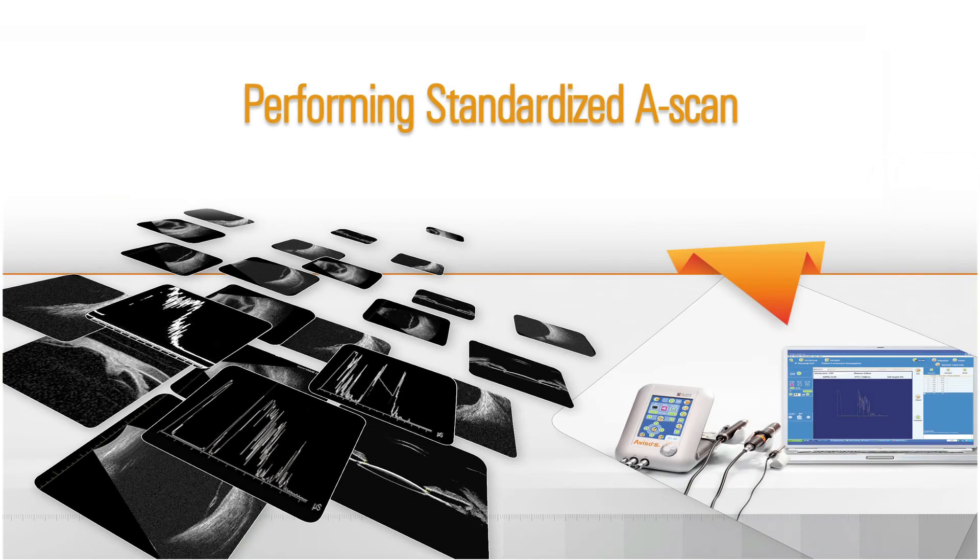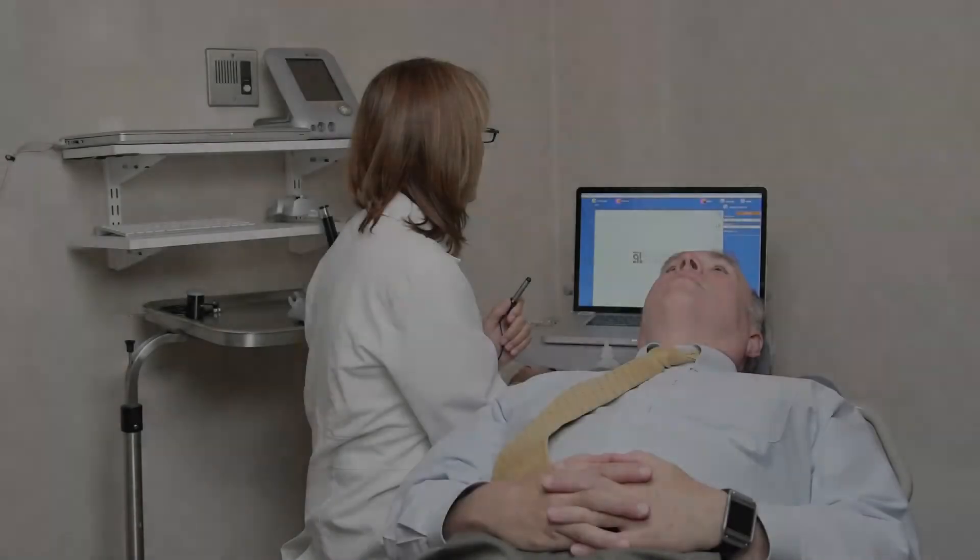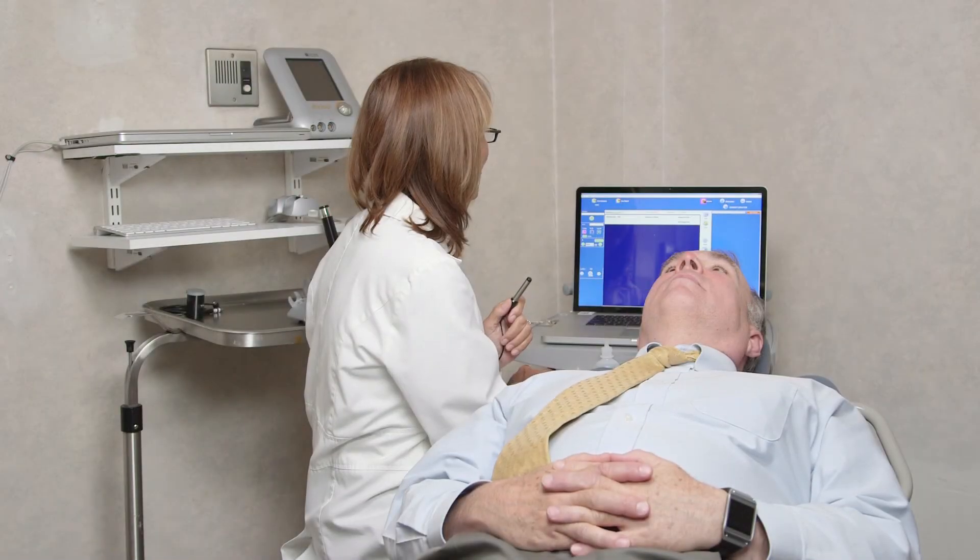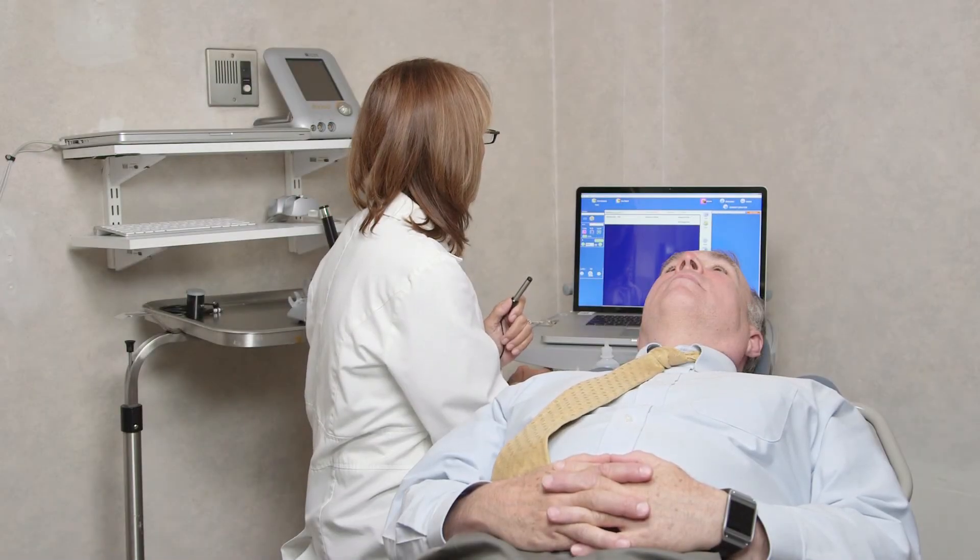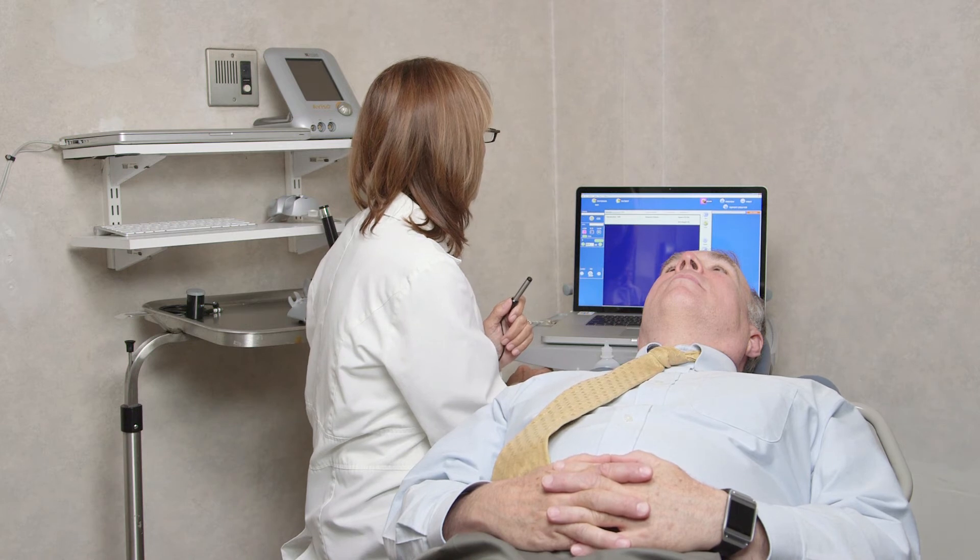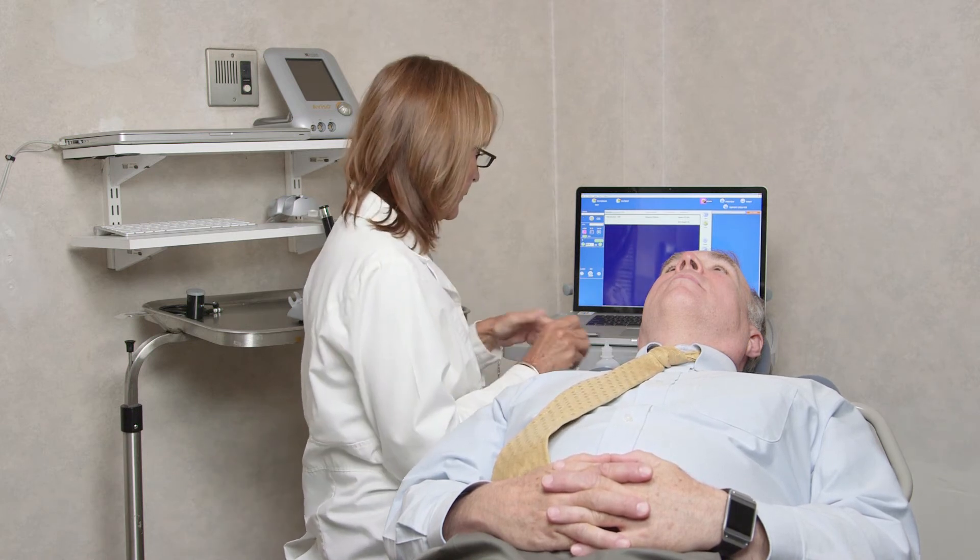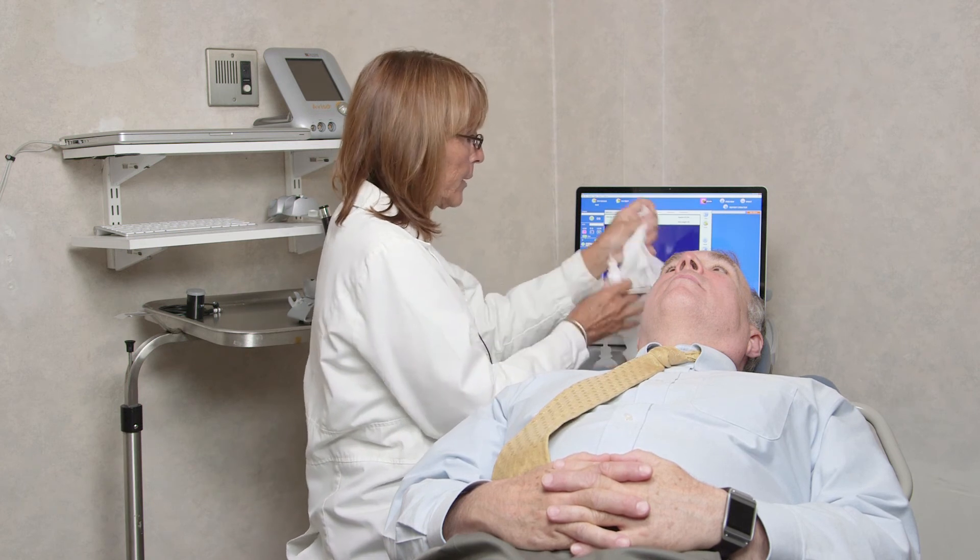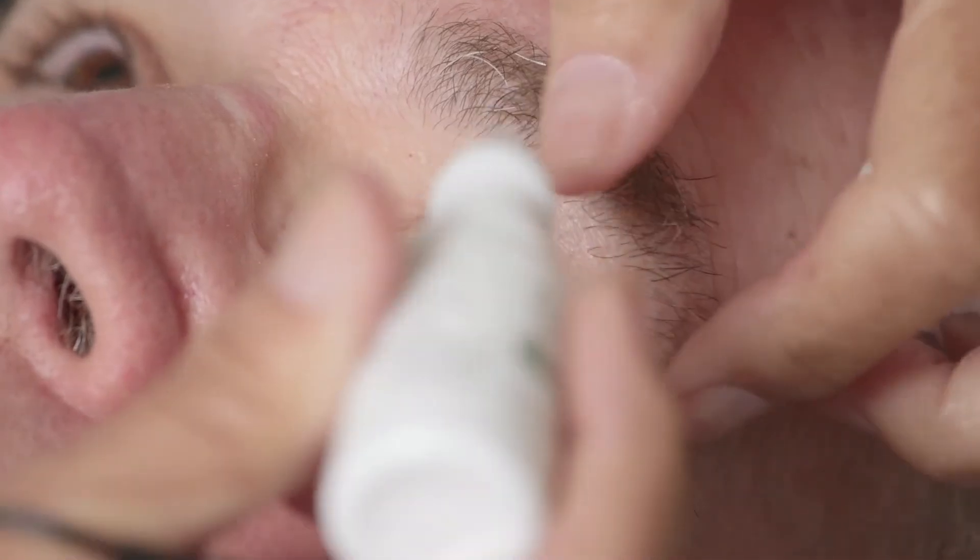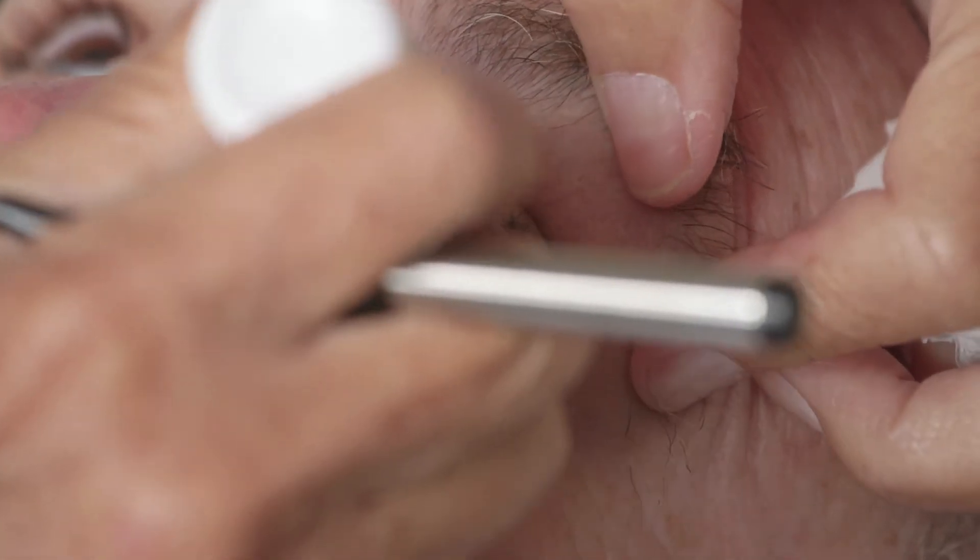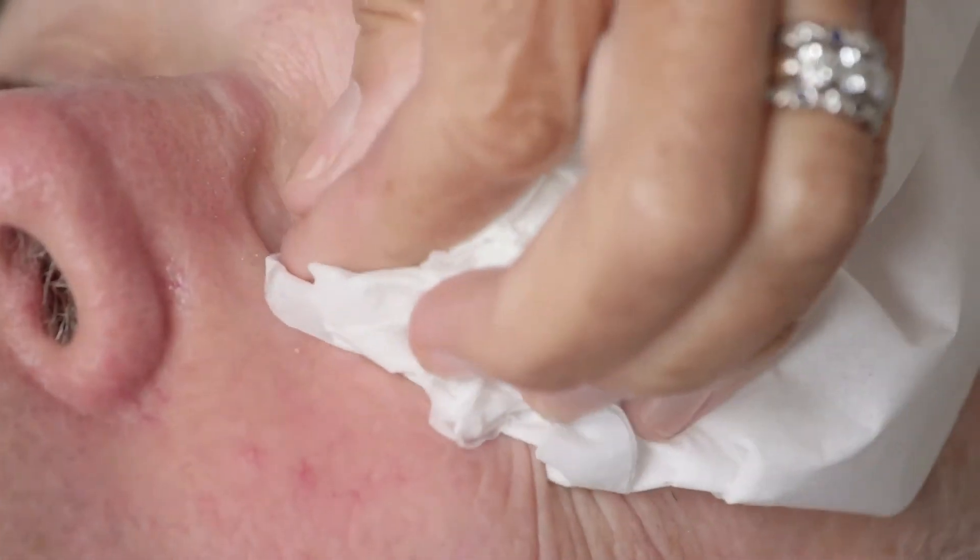Performing standardized A-scan. We can begin the standardized A-scan from any clock hour. A point to start can be selected based on the case and any preliminary B-scan findings that indicate a specific area of interest. For a complete screen, take a systematic approach every time. We suggest beginning with the sound aimed at the 12 o'clock meridian and working your way around each clock hour.